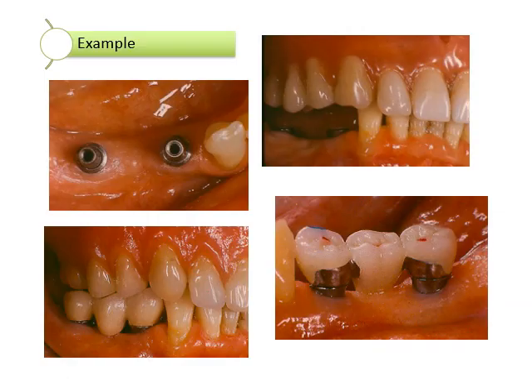Okay, this example is showing us that we have 2 implants placed in the lower right mandibular arch, and then on the lower right hand side of the screen you can see that they have placed the crown and the Pontic over the implant fixtures, and this is the Pontic right here.